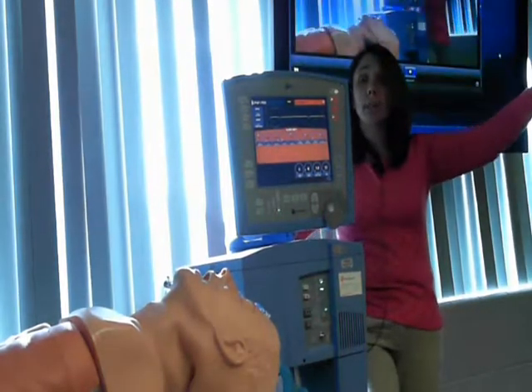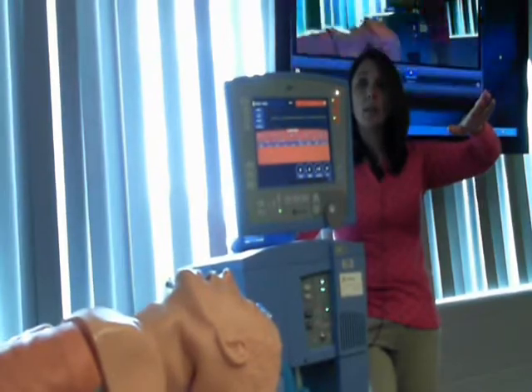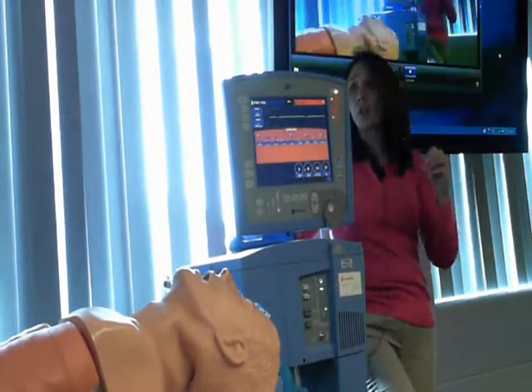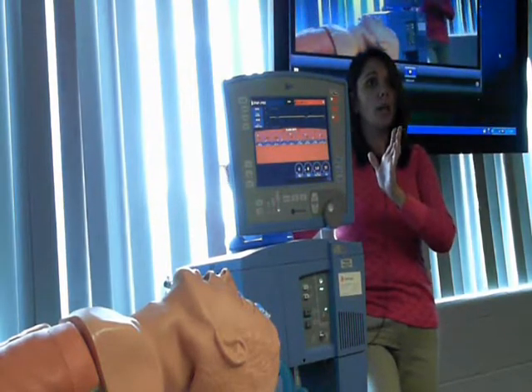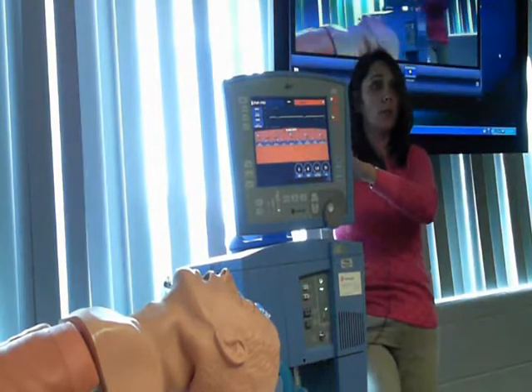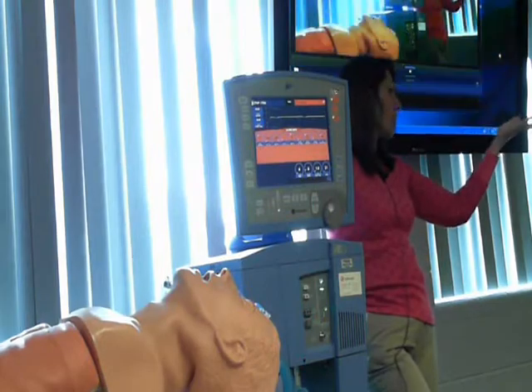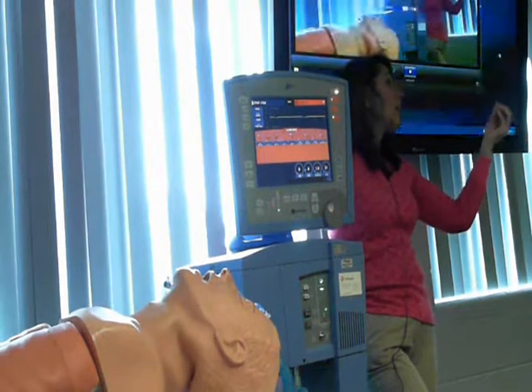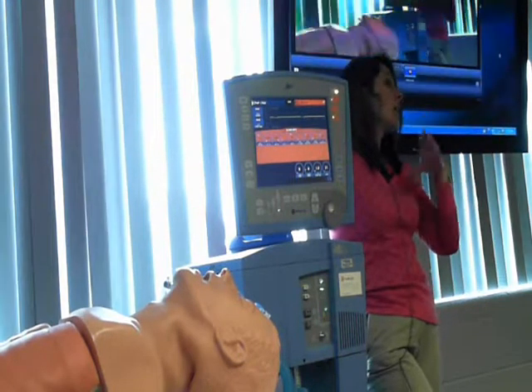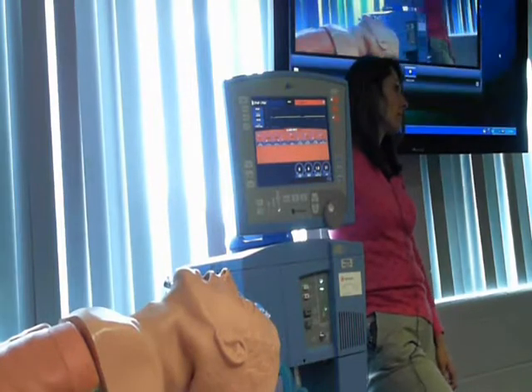Because if you knock out their ability to breathe, they're not going to take a spontaneous breath. If I increase my respiratory rate up to the 12 to 20 range, the machine is going to do that, 12 to 20 breaths per minute. So the answer would be, you could still give it if you had to, but you may want to consider talking to your other team members to see if the physicians put the patient on a protocol where you can up the respiratory rate.